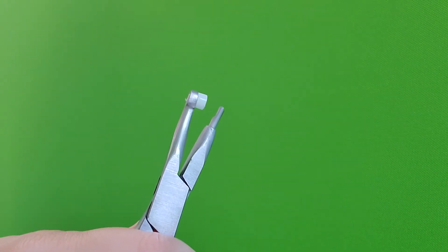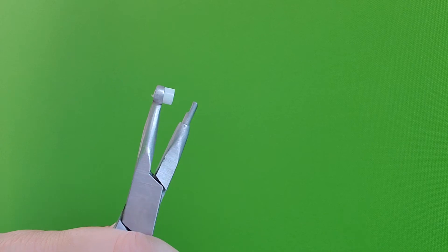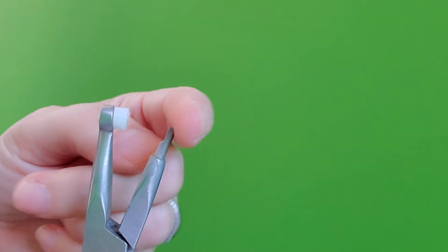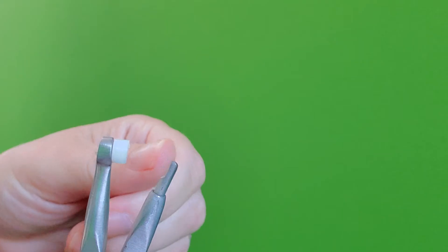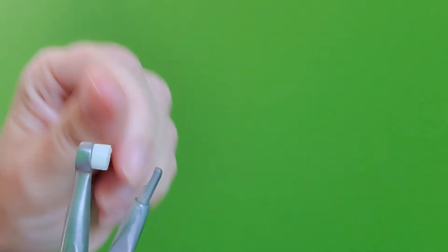This is one of my favorite instruments for that. I call it an adhesive remover. There's one that's even better than this. Some of these tips are exchangeable, and it has almost like a sharp claw.